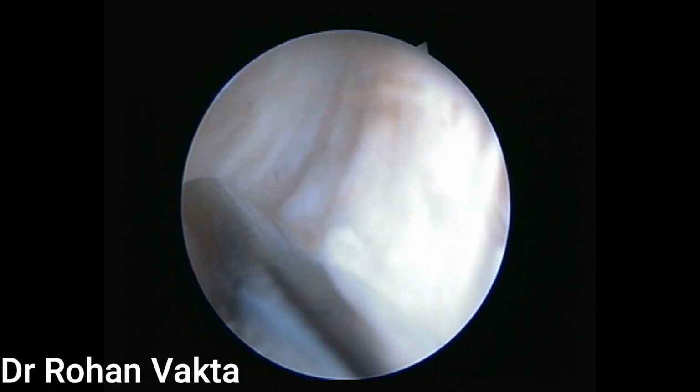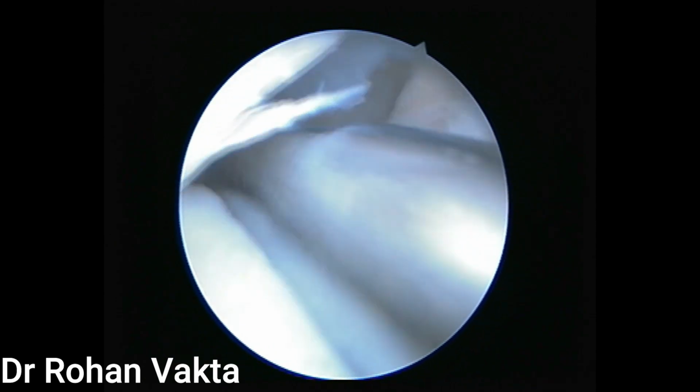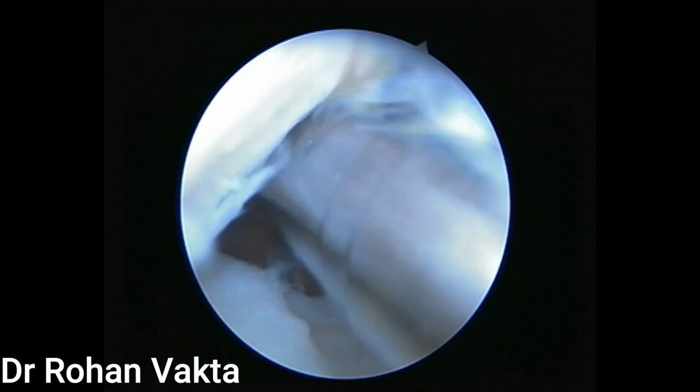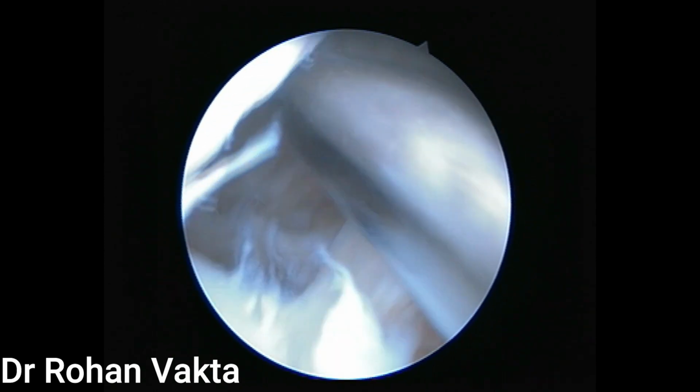highly unstable. So with the shaver, a bleeding surface is created and fibrotic tissue is removed between the meniscus and the capsule, and visualization is made better.